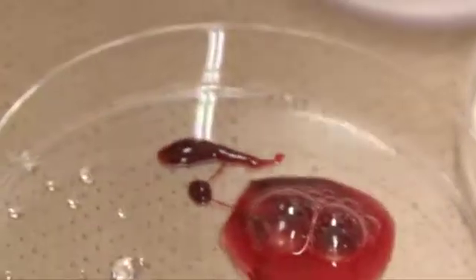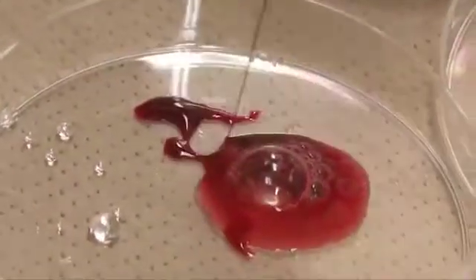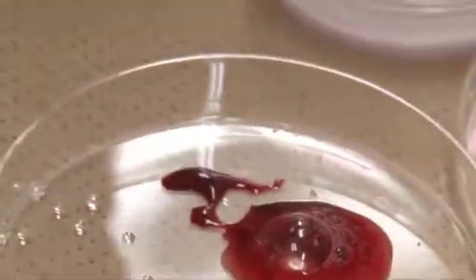So I think the camera is on the specimen. Is it mucoid or not?